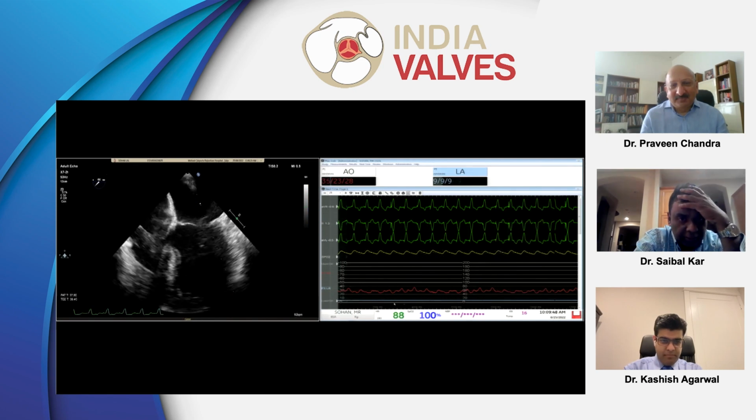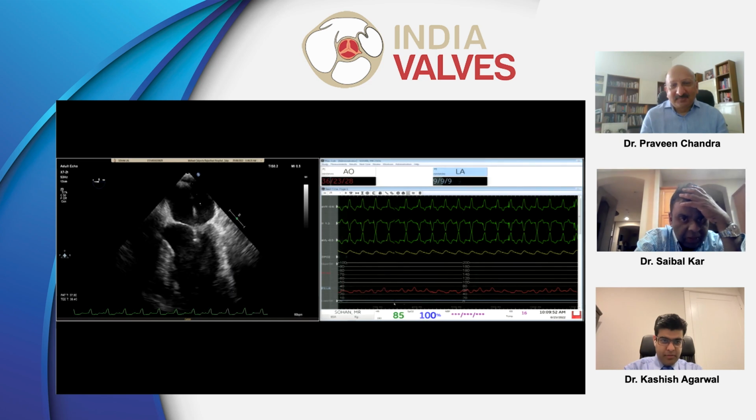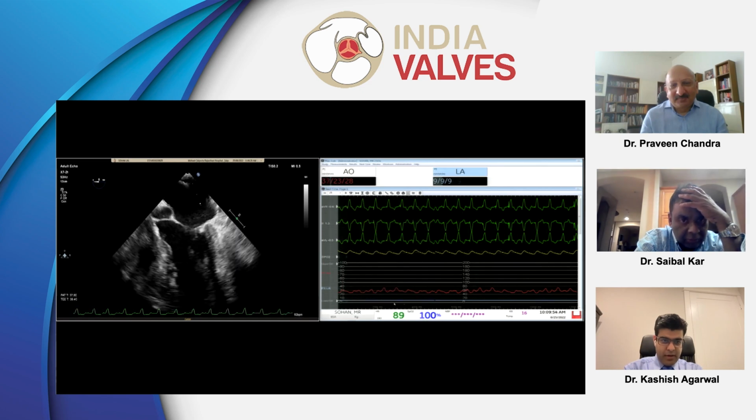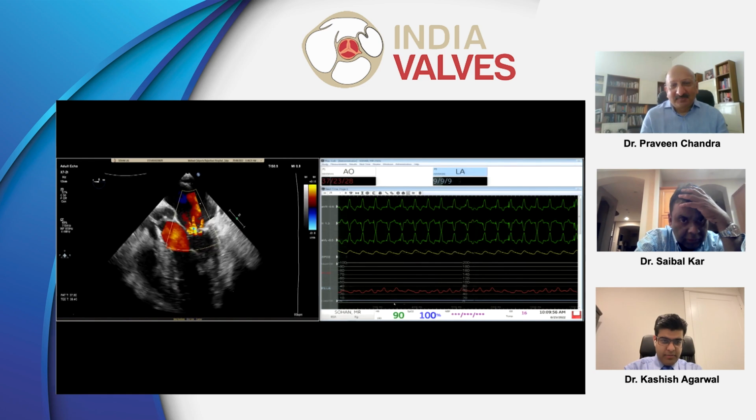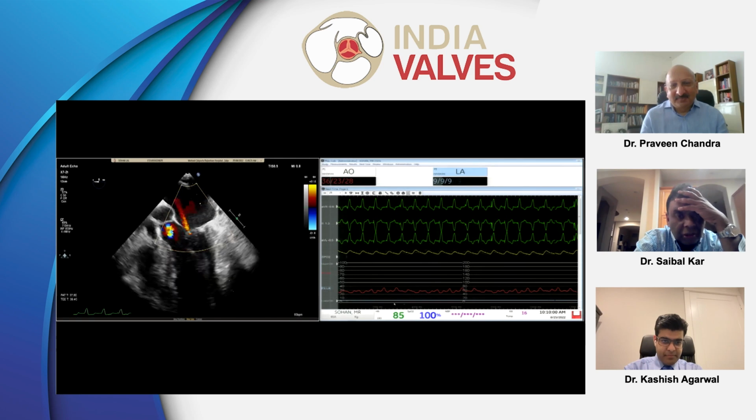No. Evaluate the MR and also evaluate the leaflet insertion. The leaflet is inserted very well. And gradients and 3D and all that. And the pulmonary vein, sure. Okay, so there's no MR. See how the eccentric jet is gone?